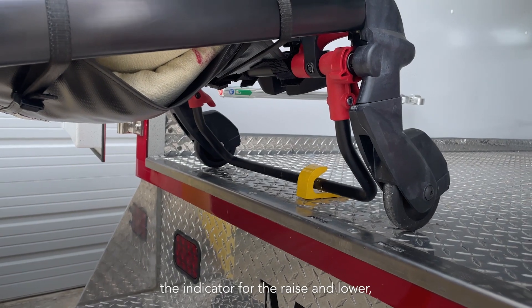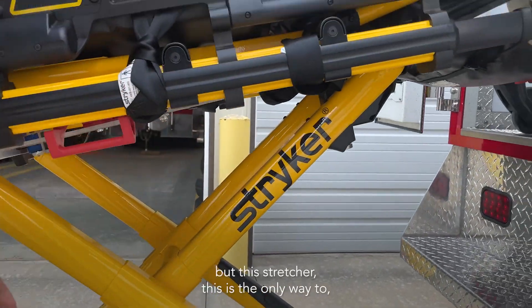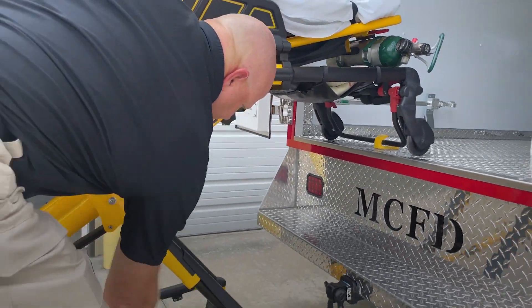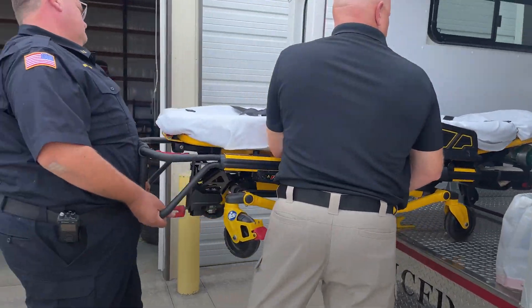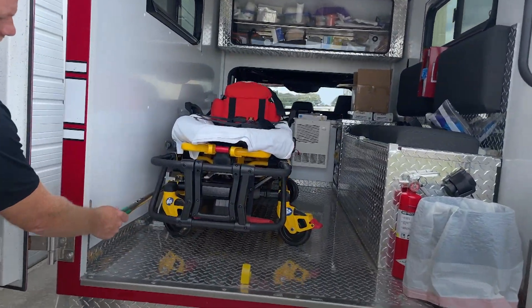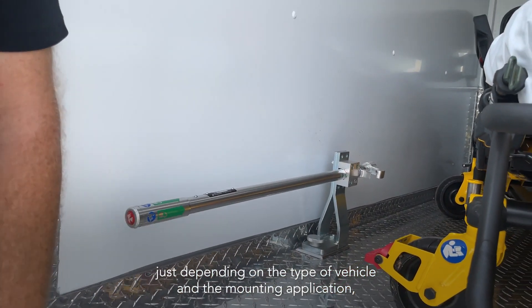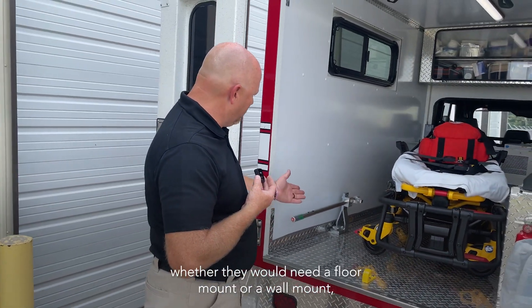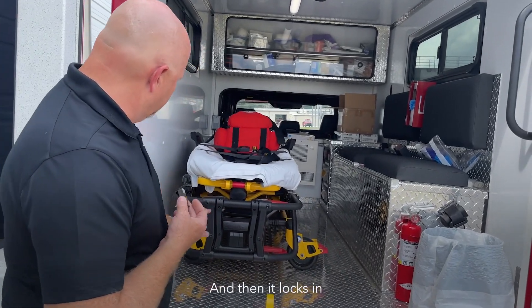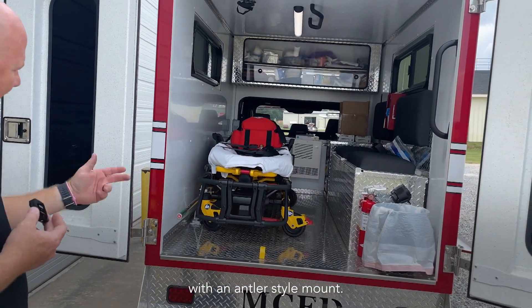When you load a manual stretcher, on the bottom bar you'll see the indicator for raise and lower. There is that option on a power stretcher as well as a manual override, but with this stretcher the only way to get it into the vehicle is to manually lift the wheel. It locks in, and it also mounts into the wall. Depending on the type of vehicle and mounting application, you would need either a floor mount or a wall mount. The front wheel catches the antler and locks into the vehicle.